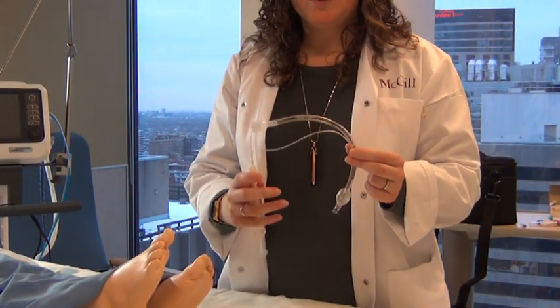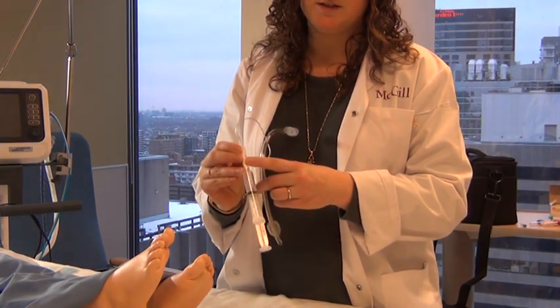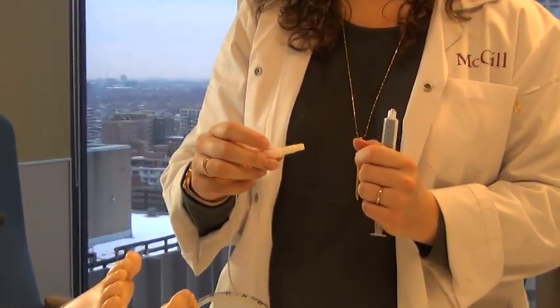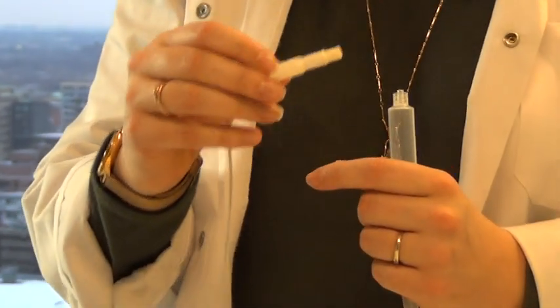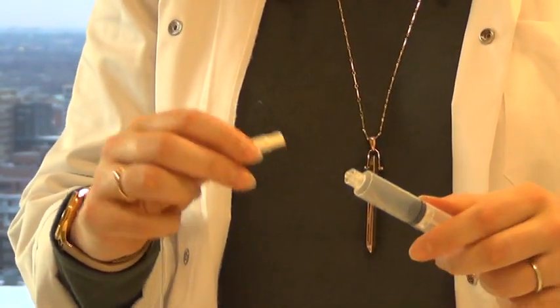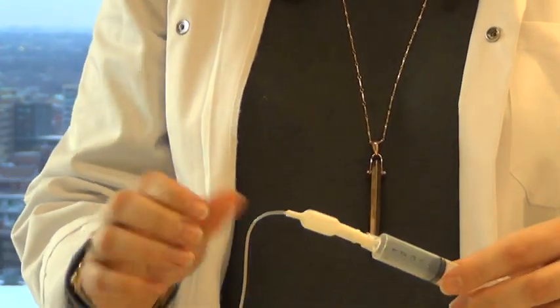That being said, there is also a way to measure and to connect a manometer directly to this cuff that we could connect right here to actually measure the proper pressure in this cuff. And this is usually done by respiratory therapists when they'd like to ensure that the balloon is properly inflated.